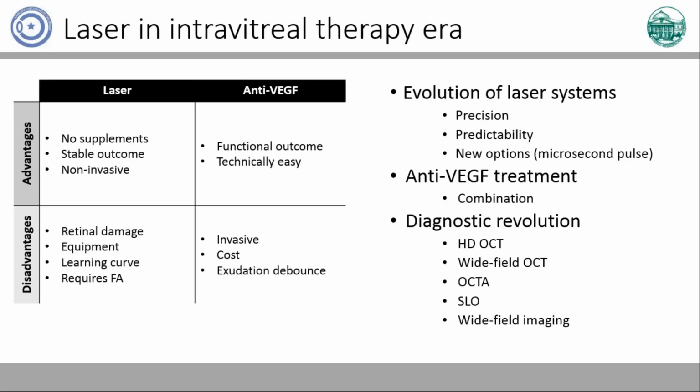The third thing I would like to discuss is that we are living in the anti-VEGF era today. But I strongly believe that laser is still an adequate, very good and safe option to treat some retinal disorders, specifically macular disorders, including diabetic macular edema and CSCR. Several things are important.